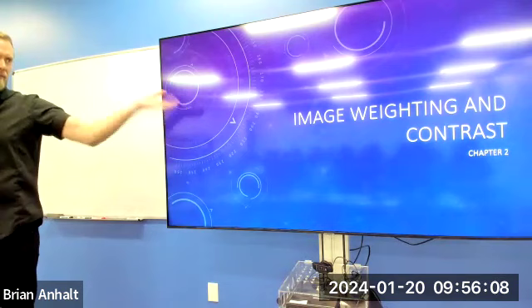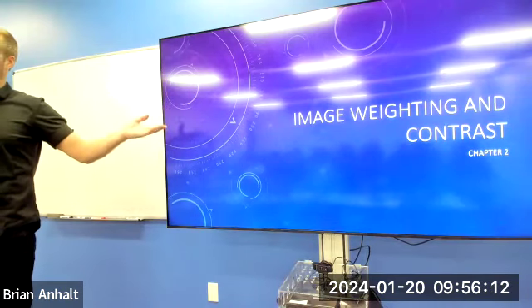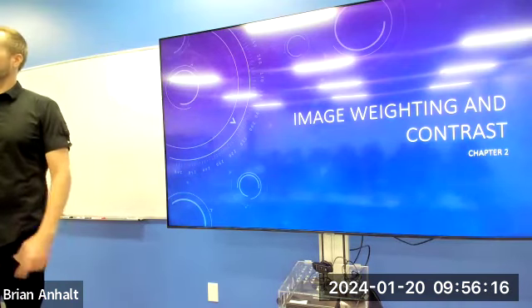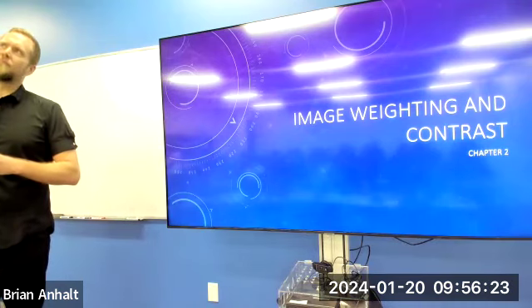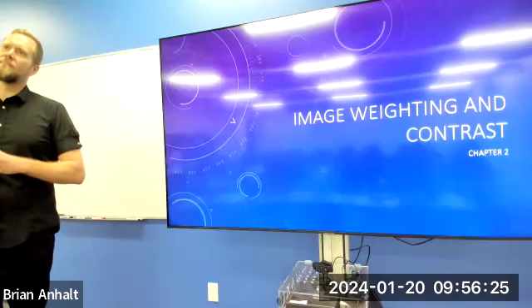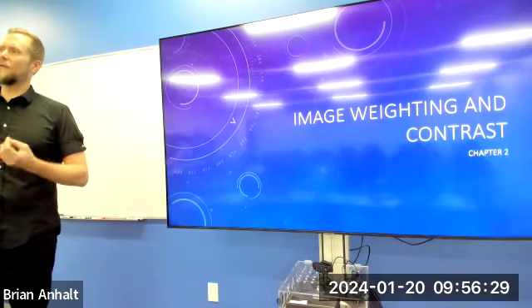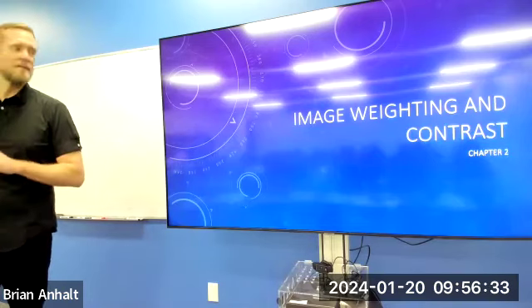So we got to understand why is it weighting? What does that mean? Why does it say that? And first of all, what is contrast? Weighting is giving preference. Giving it more weight. It's giving preference to something. It's giving more preference towards T1 or T2 contrast, essentially.